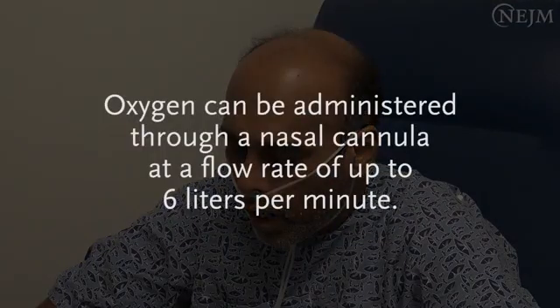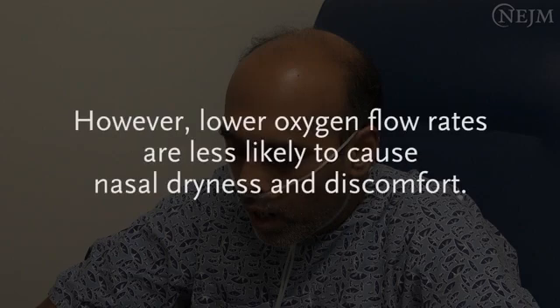However, an increase in minute ventilation, that is, the volume of gas inhaled or exhaled in 1 minute, or mouth breathing, can dilute the oxygen and result in a lower fraction of inspired oxygen or FiO2. Oxygen can be administered through a nasal cannula at a flow rate of up to 6 liters per minute. However, lower oxygen flow rates are less likely to cause nasal dryness and discomfort.